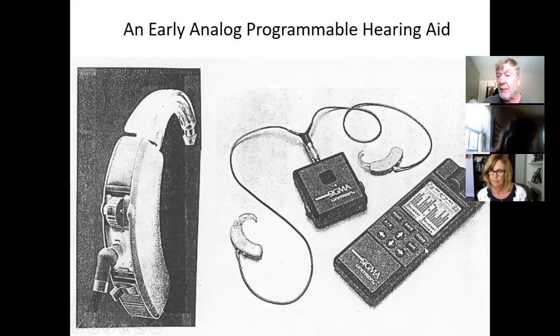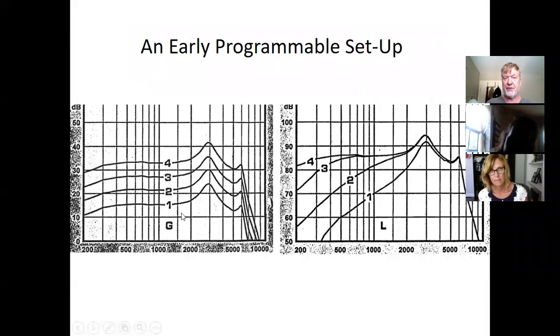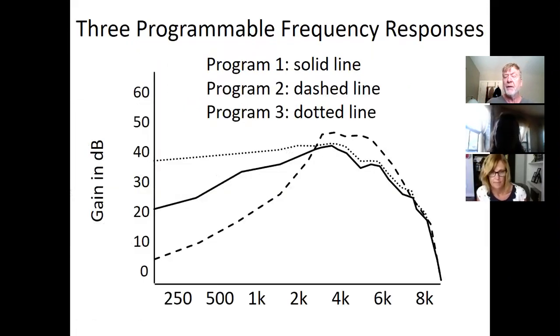So you didn't program with your laptop or desktop computer with manufacturer software on it. You had a little handheld programmer dedicated only to that task, and you could program the guy's hearing aid. You could make different outputs or different gains for the lows. You could play around with stuff and then store it, programmed.